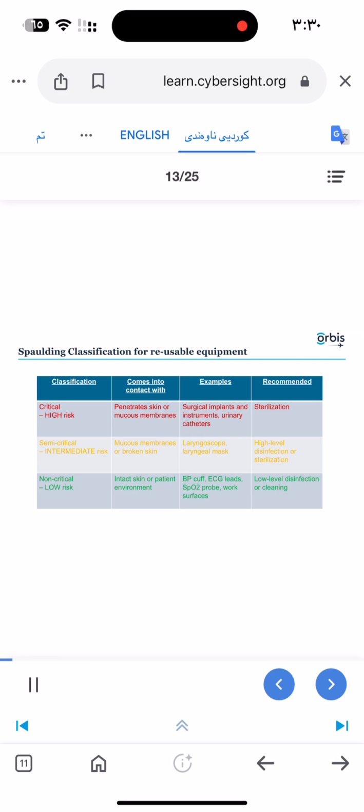The Spalding classification, originally proposed in 1957, is a widely used system for matching the disinfection and sterilisation of surfaces, particularly those of reusable medical and surgical devices, with available processes. This is a three-stage classification: high risk, intermediate risk and low risk.